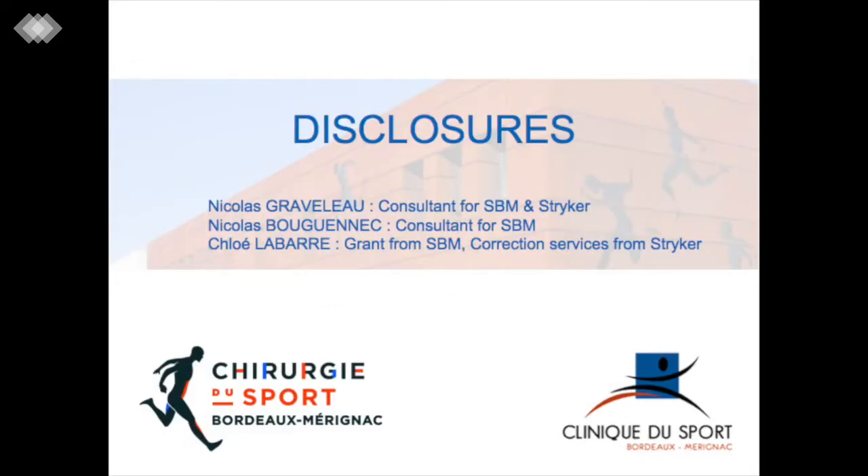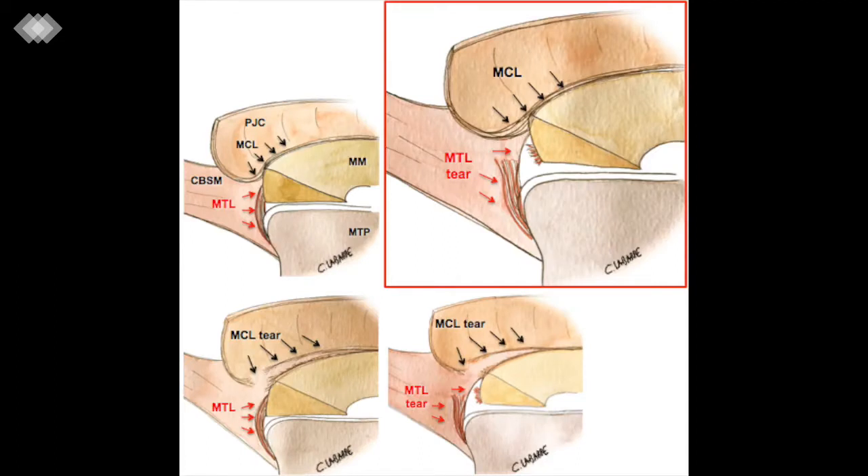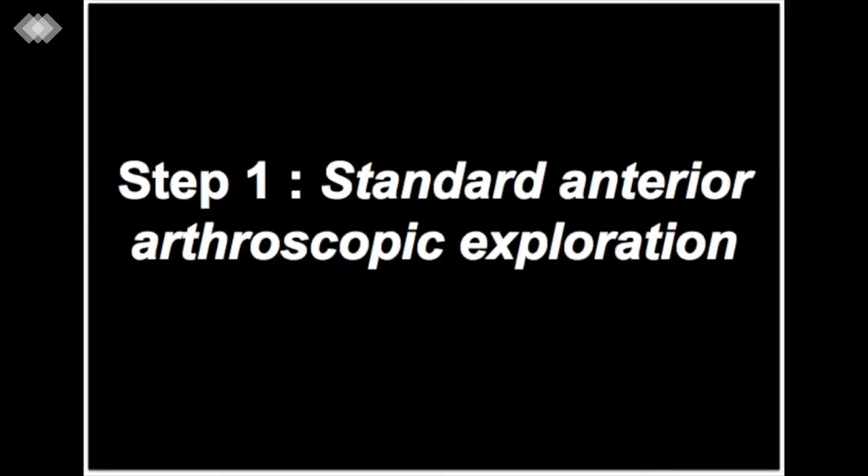We perform all procedures with a classic 30-degree arthroscope. The medial compartment examination and the diagnosis of a posterior peripheral lesion are conducted in three steps. Step 1: Standard anterior arthroscopic exploration.